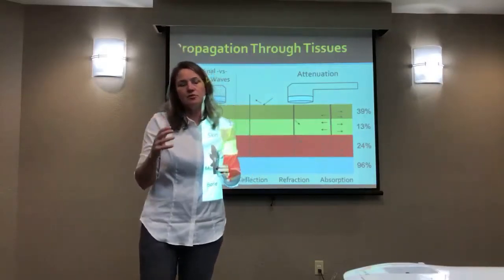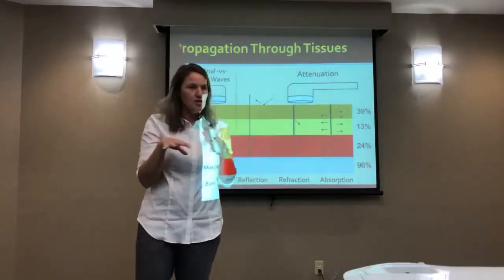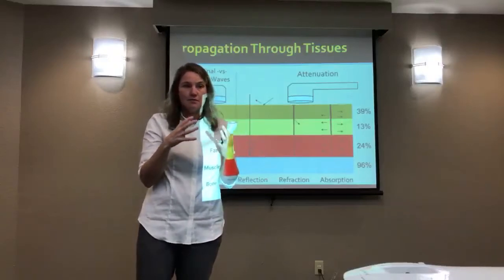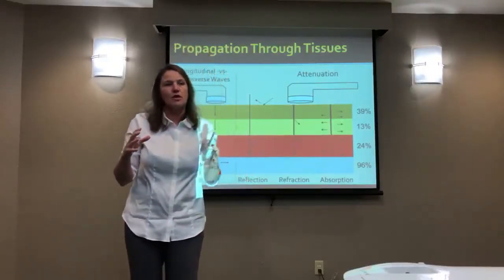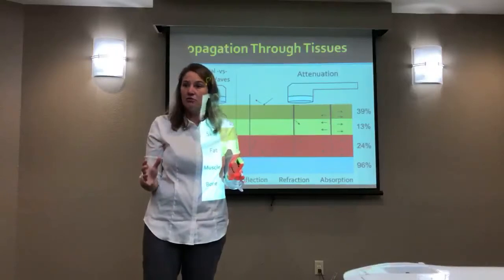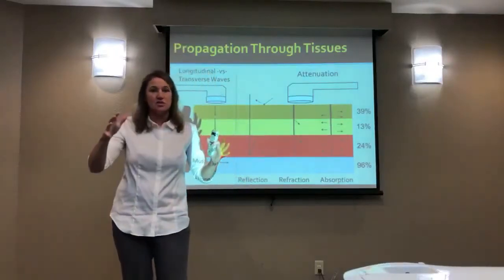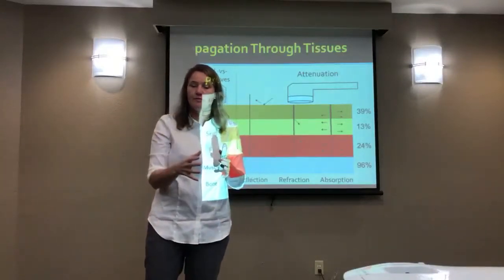And so anytime you're doing ultrasound, as soon as it enters the body, even in your coupling medium, it's possible that if your coupling medium isn't ideal, it may already have started scattering a bit. So what will happen is it takes your uniform energy that's coming out of your sound head, and it's making it non-uniform, because this happens non-uniformly. So it's causing it to spread and become less dense and less uniform. I like to describe it as like a flashlight.